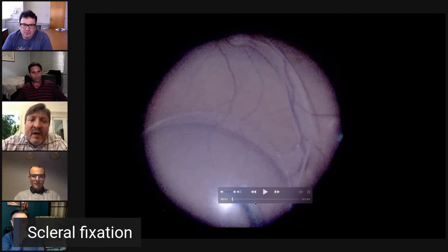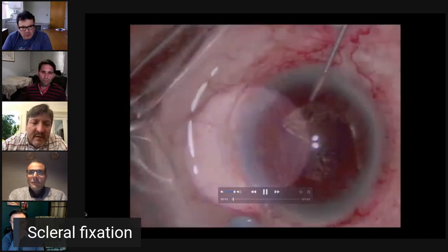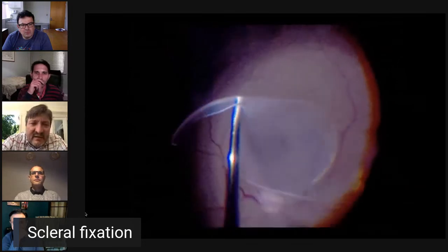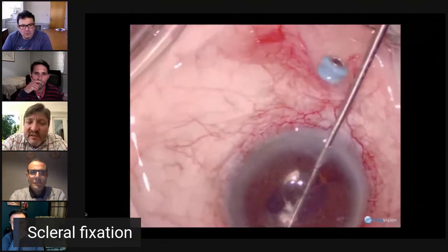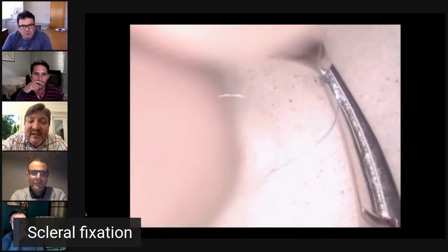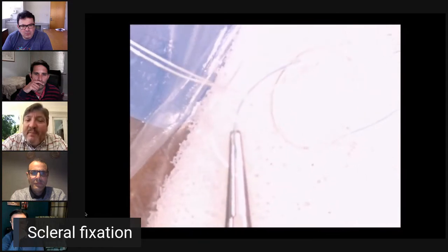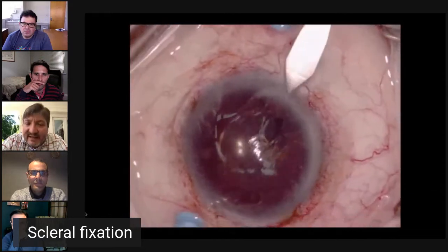So this is a case of a patient that had a suprachoroidal hemorrhage in the other eye during routine cataract surgery. A high myope presents with a lens on the macula several months after complex cataract surgery, and I'll let it play here. Here again, I'm lifting the IOL with suction from the cutter. This case, the video is a little grainy. This is one of my very first 3D heads-up cases that I did back in 2011, actually, and you see here I have an MA50 lens. I'm putting the Gore-Tex girth hitch around the lens haptics.